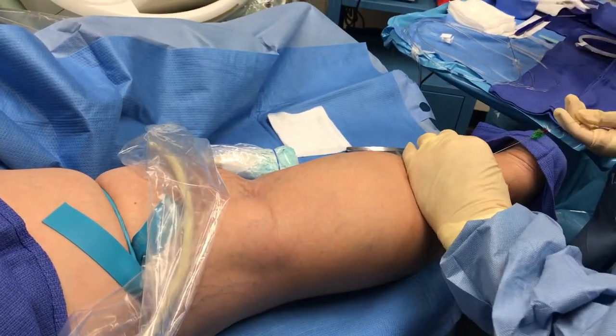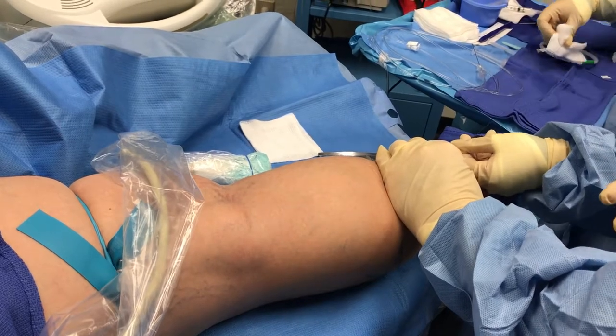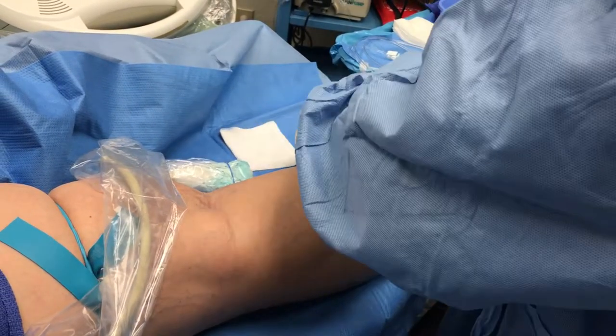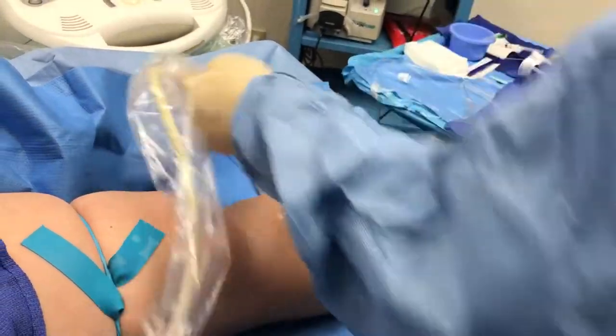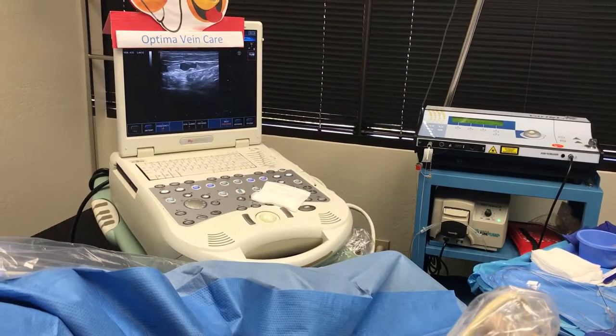So we'll take the needle out. It's important to hold tight here when cleaning up, because I have had people pull that thing right out — and it's a hard bit. I have to start again when it happens. So we'll try and follow this wire up.